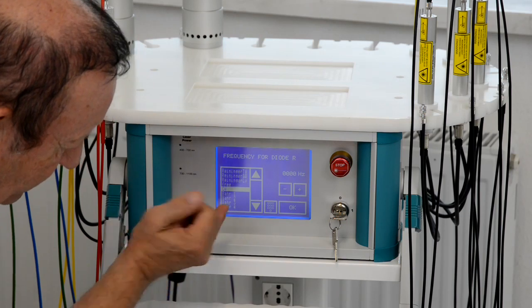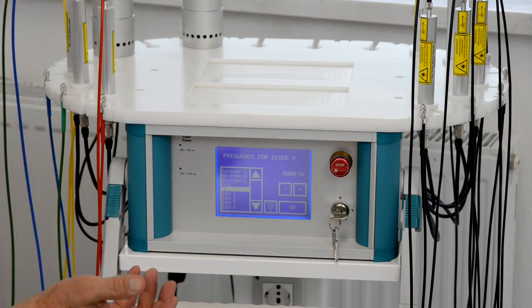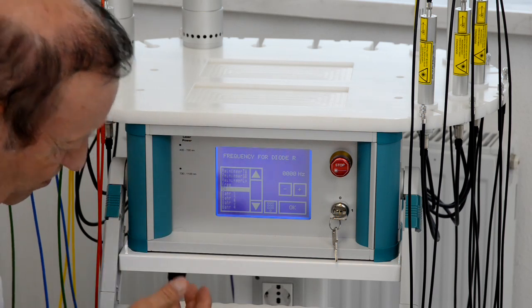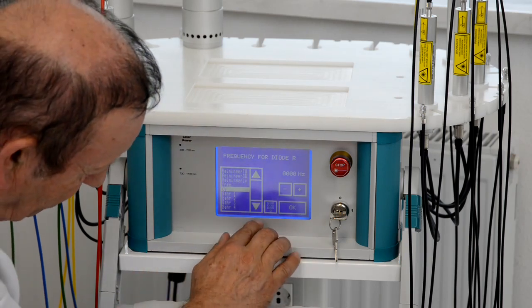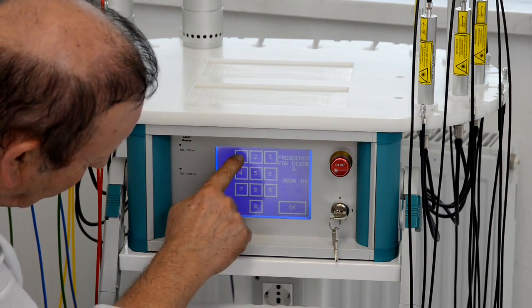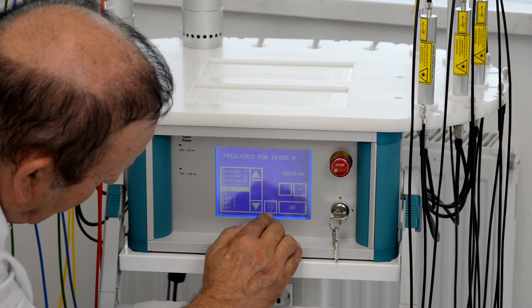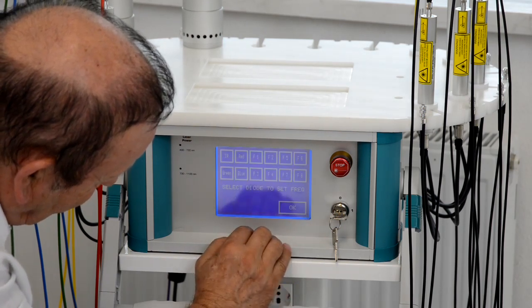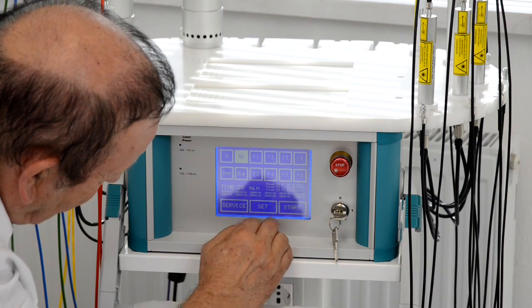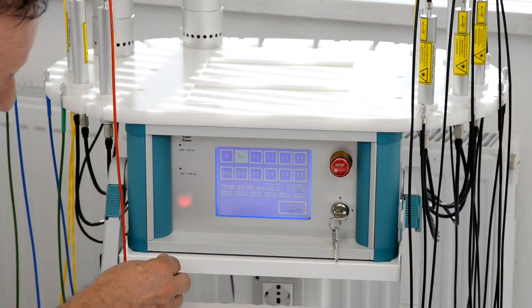And then you can see in the screen that we have already preset different frequencies. So there are acupuncturists using the so-called Nogier frequencies, Bahr frequencies and meridian frequencies. But maybe I want to set a free frequency myself. I press here, and then maybe I want to use a frequency of 10 Hertz. You see 10. I confirm the 10 for the red laser. I will not change anything else, so it's okay. So I don't want any other one. Press OK. And now I start my red laser. And you see the red laser is now working with 10 Hertz.